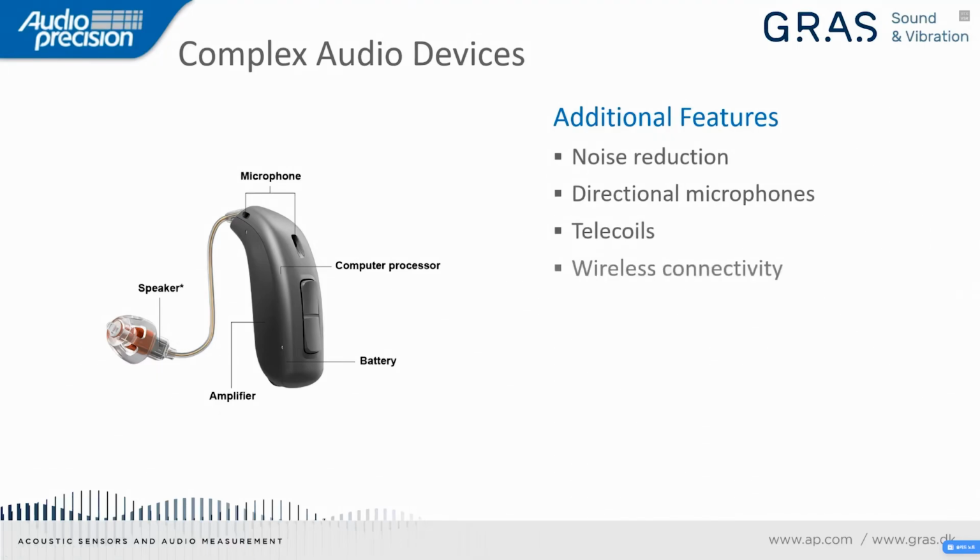Many of them have wireless connectivity. In earlier days, most of the hearing aid manufacturers had their own proprietary Bluetooth protocols for transmitting audio, and now the Bluetooth SIG has just come up with a standard for hearing aids that will allow all manufacturers to adopt the same standard, and I think we'll really see the Bluetooth take off from there.